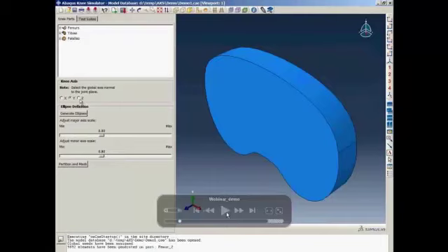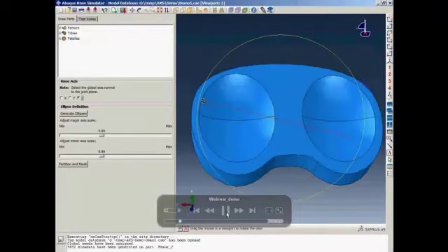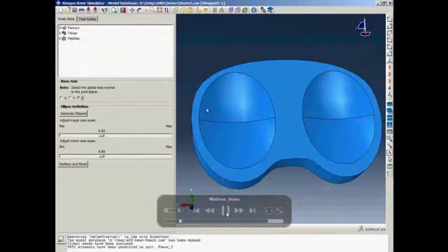So here, this is the semi-automated tool we provide to generate the hexahedral mesh for the contact area. The first thing that you'll be prompted for is the axis that's representing the global knee axis, which in this case should be the z-axis. So this will be the axis we use to generate the ellipses used for the positioning.